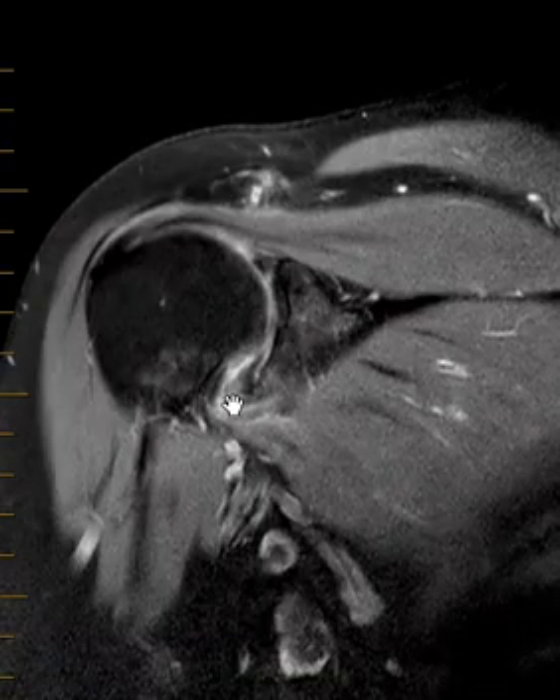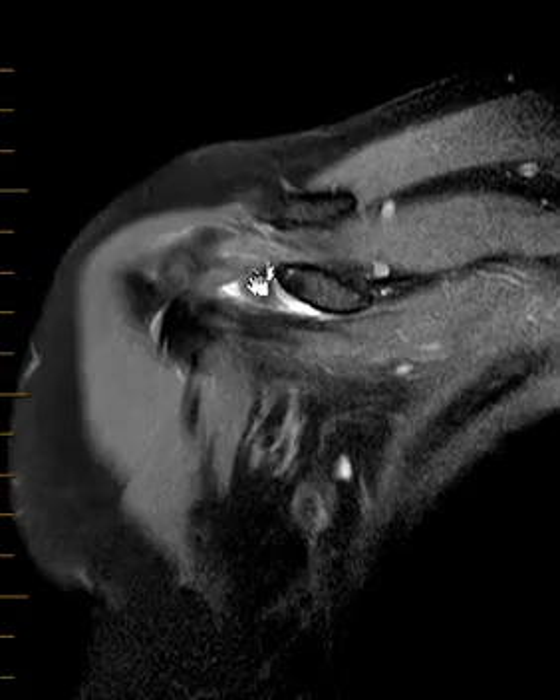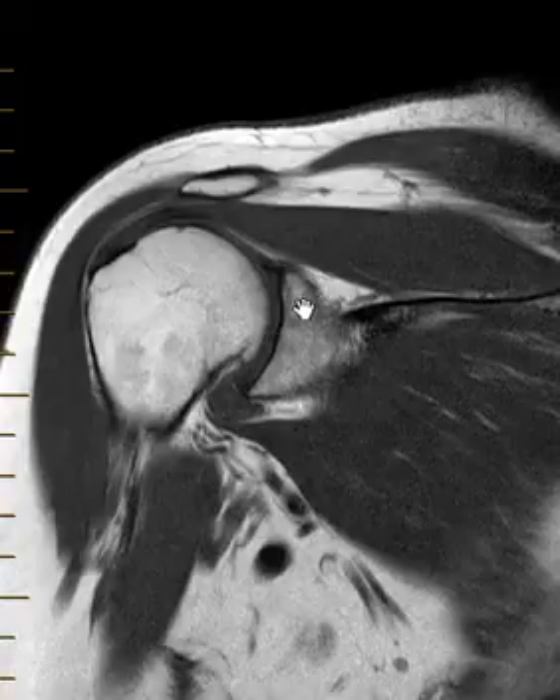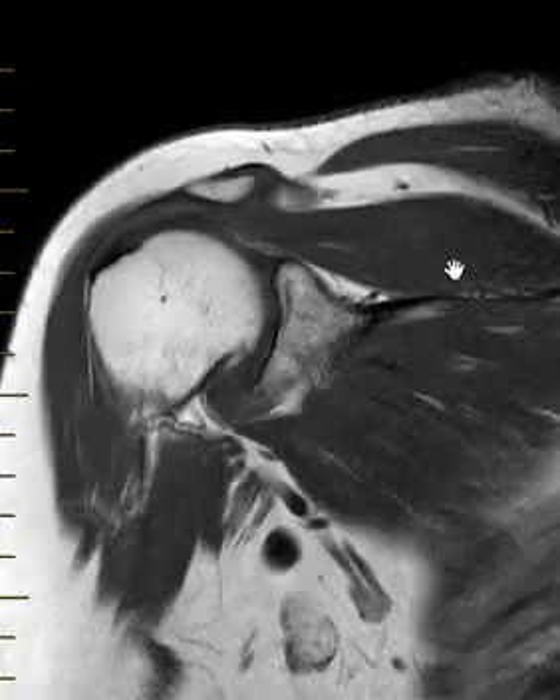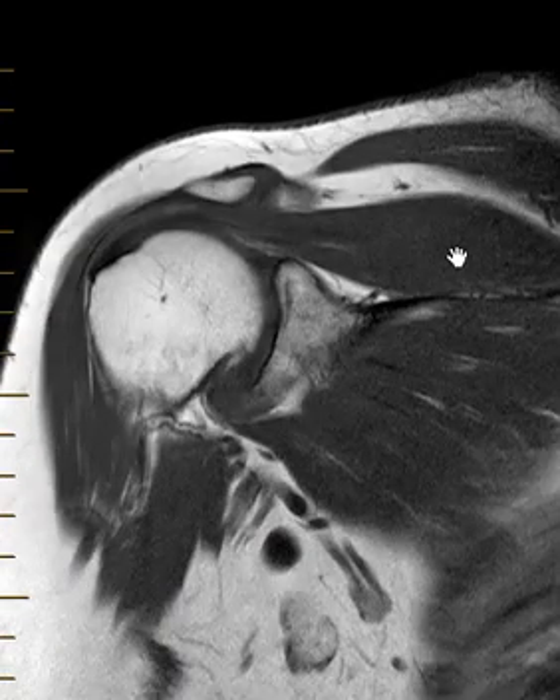A little bit of bright signal. And again, up around the coracoid process, especially in the T1 images, we just don't see any nice clean fat collection. And that's it — this is an example of a very mild, kind of subtle, adhesive capsulitis.